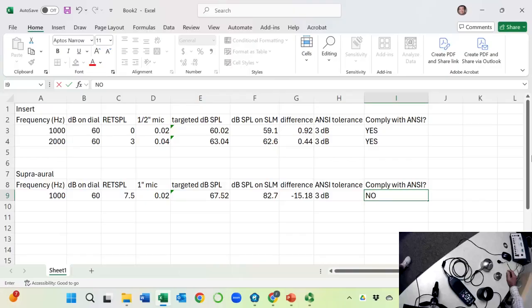So luckily there is something called an artificial mastoid. When I first heard the term, I thought it looked like a temporal bone, because the term is artificial mastoid, mimicking the response of a human mastoid. It must look like a mastoid. When I got this, I thought they gave me the wrong piece. I ordered an artificial mastoid. This is what they gave me. A piece of plastic. You kidding me?